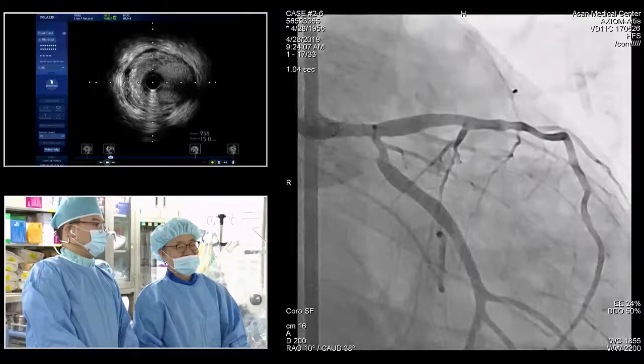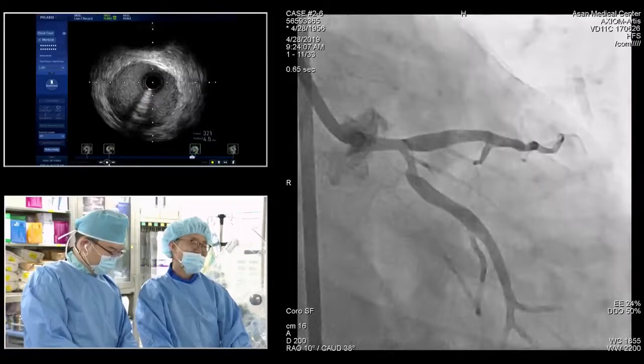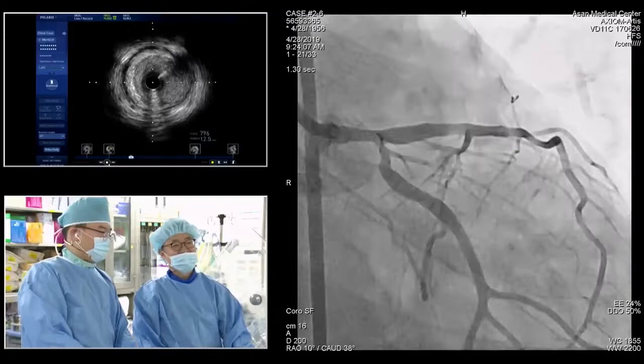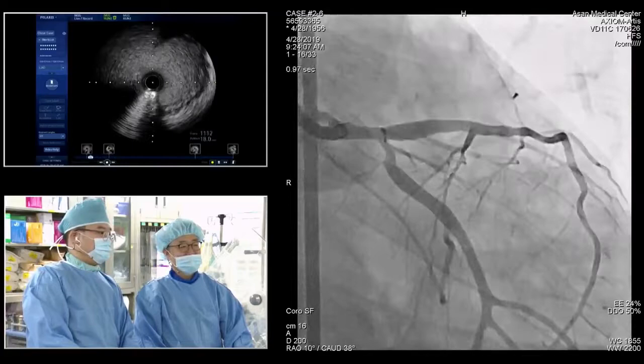No, I agree. We see this every year at TCTAP. I remember doing two cases like this for you at this course. And I never see this in the United States. No, but Greg, to clarify, the idea is not to jail the LAD. After the stent and POT, we would do a mini kissing with the nose to give access to the LAD for the future. Now, the LAD is a large vessel. Is there any particular stent that people would like to use so we can maximize the opening into the LAD?